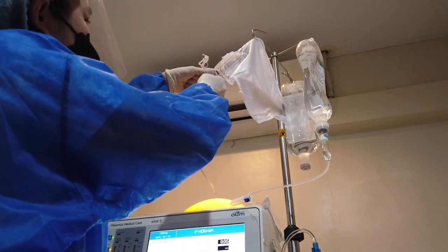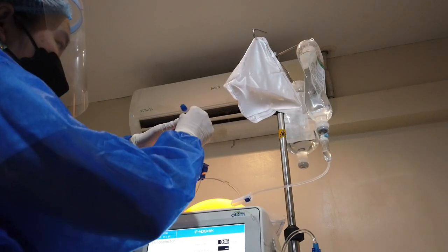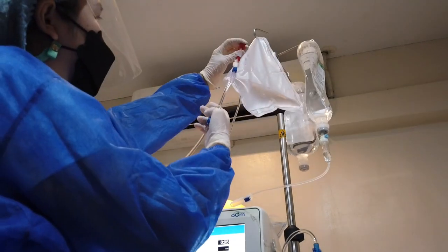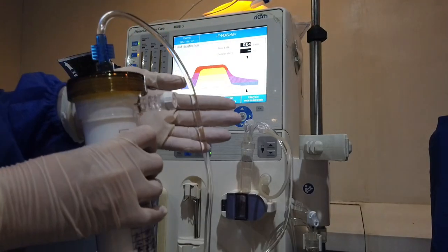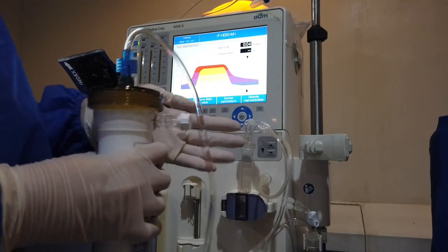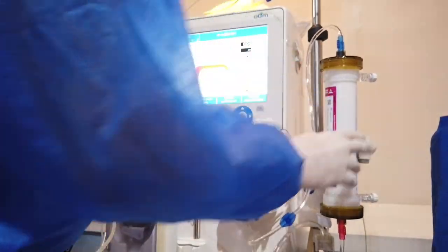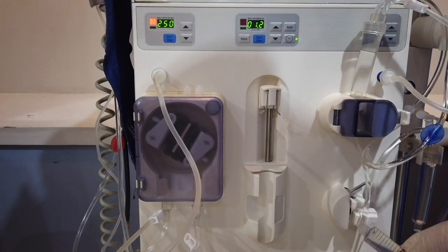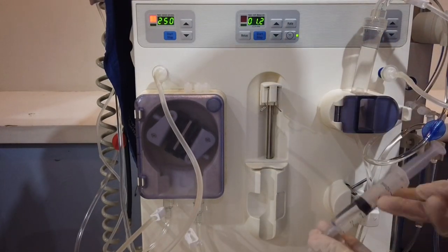Detach and connect the venous patient's end to the arterial patient's end. Unclamp both big clamps, then start blood pump to start recirculation. Continue to expel air bubbles from the dialyzer. Following the doctor's order, attach the prepared heparin syringe to the heparin line.